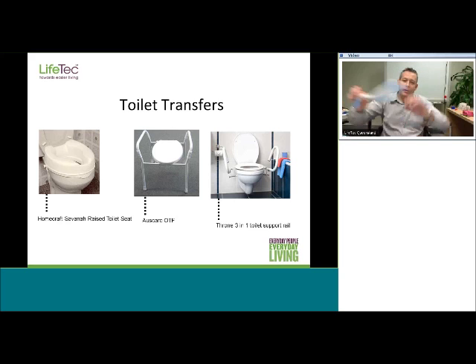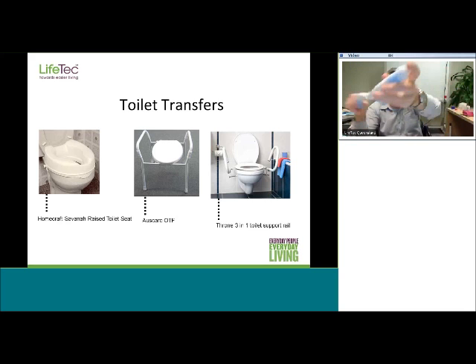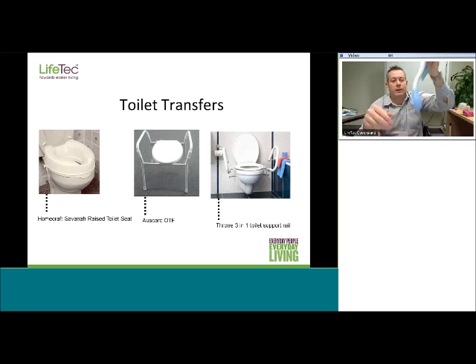While we're talking about toileting, if someone has reduced reach for hygiene, you might want to look at the Buckingham Easy Wipe, which you can see on screen. So it's got a button on the end which you push down, and then while holding down the button, you wrap toilet paper around the end, and then release it, which secures the toilet paper. After you've used it, you simply push the button and shake the toilet paper into the toilet. So they retail for around $70.